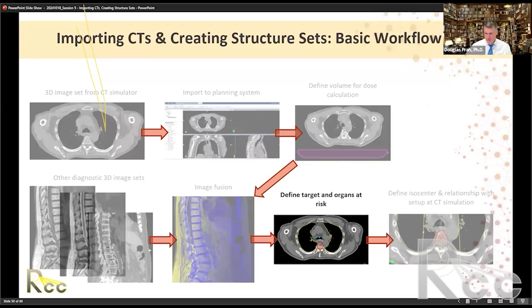We've got another question. What is your recommendation for BBs for CT ISO in the case of deep inspiration breath hold, as it moves while scanning? Additionally, do you have any insights on planning with VMAT for DIBH? While it may not seem practical, I would appreciate your advice and thoughts on this matter.